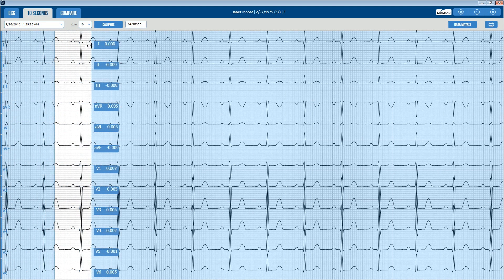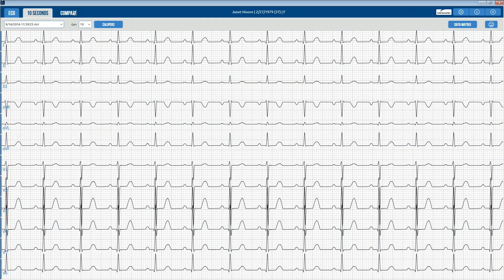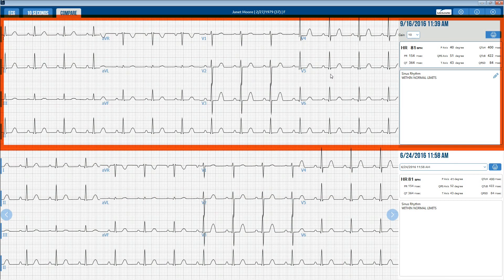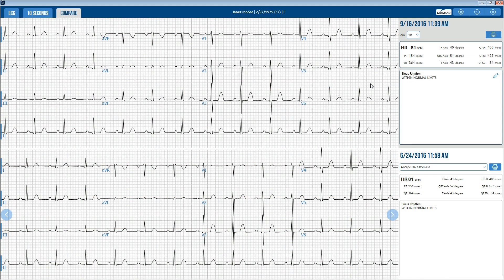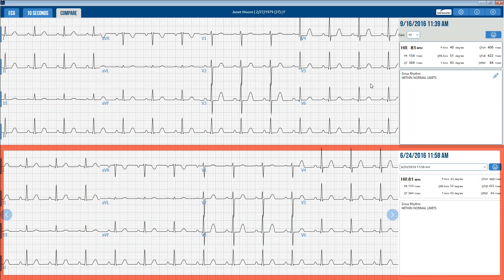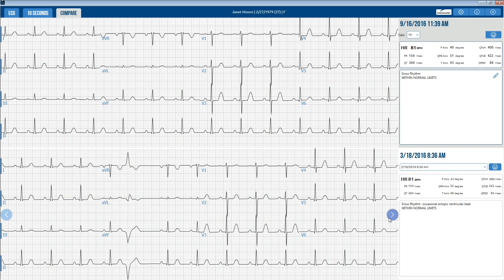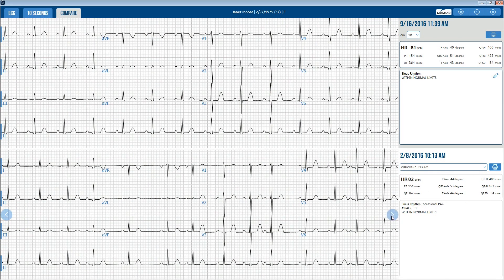You may click the Compare tab to compare two ECGs from the same patient side-by-side. The current test report will be displayed in the top window. The previous test report, by default, will be displayed in the bottom window. Other tests can be selected by using the drop-down menu or by using the right or left arrows in the bottom window of the ECG report.